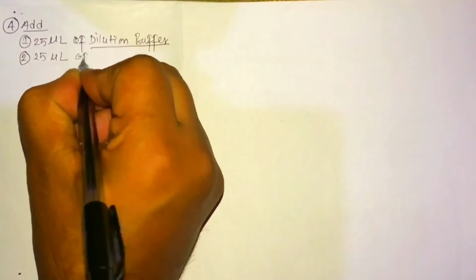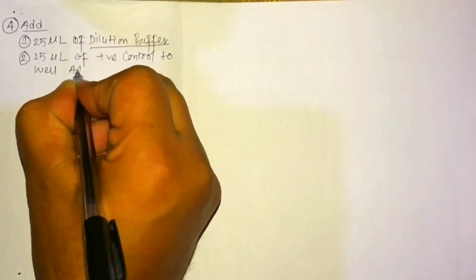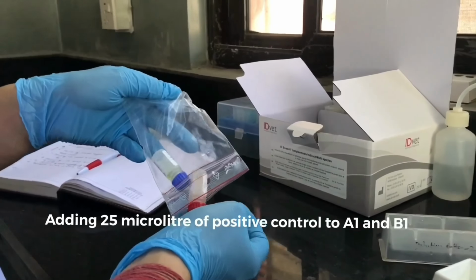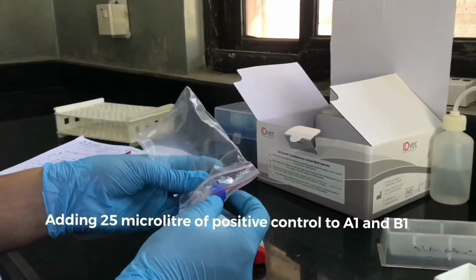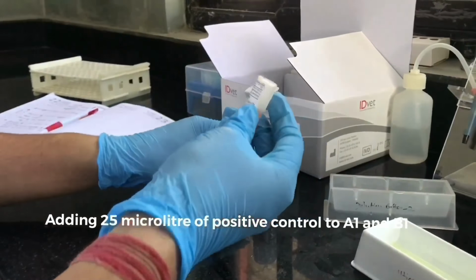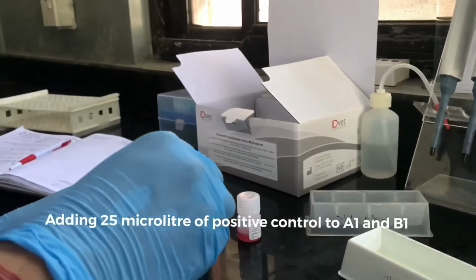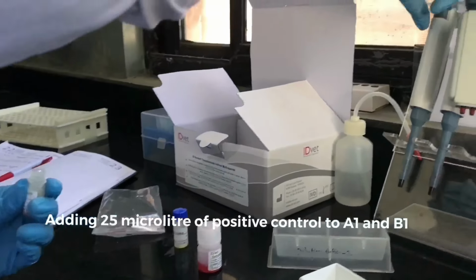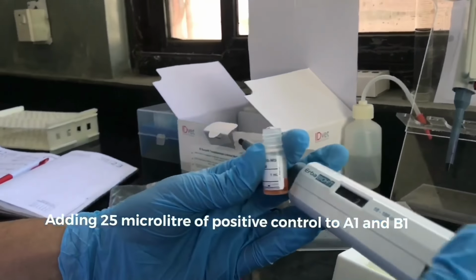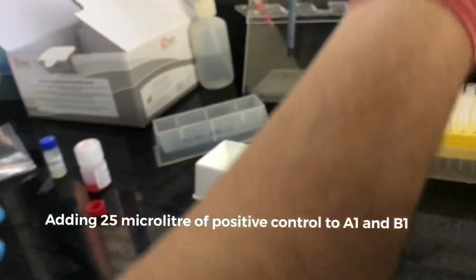Now we will be adding 25 microliter of positive control to the wells A1 and B1. So this is the positive control. It is provided in the kit itself. So we just use it like that, without dilution buffer. We'll be adjusting it to 25 microliter.